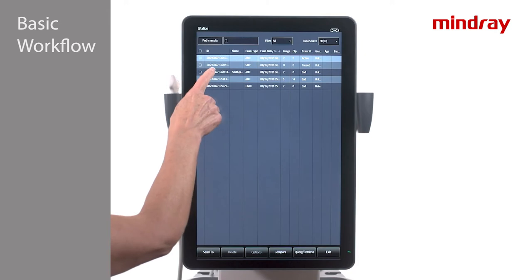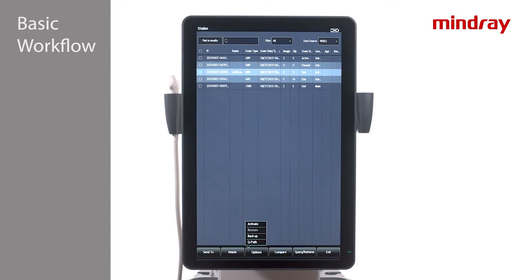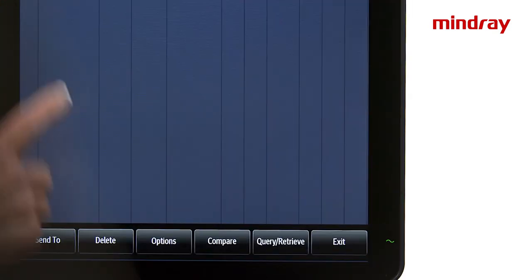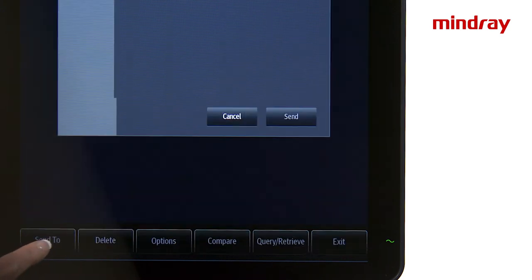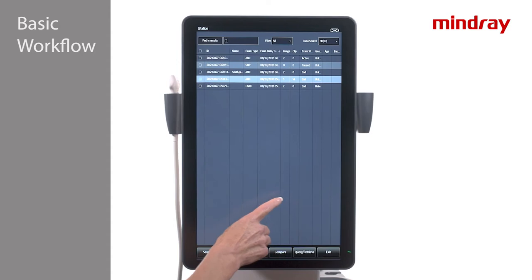To do this, highlight the desired exam and tap Options at the bottom of the screen. Available options will be illuminated. To send an exam, highlight the desired exam and tap Send To along the bottom left and choose the destination. This concludes the chapter on basic TE7 workflow. Next we will review the main imaging controls.